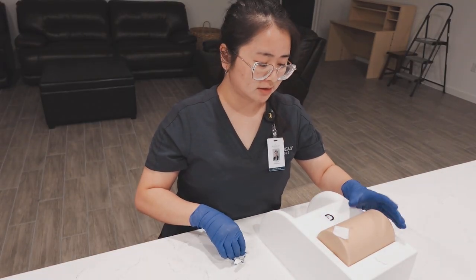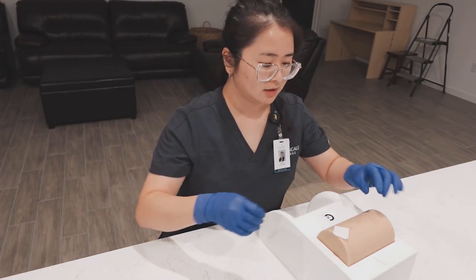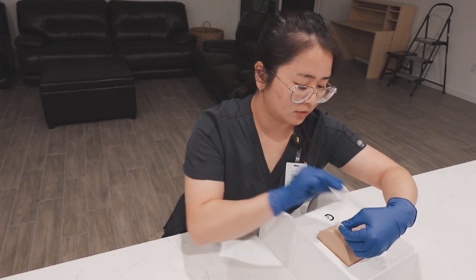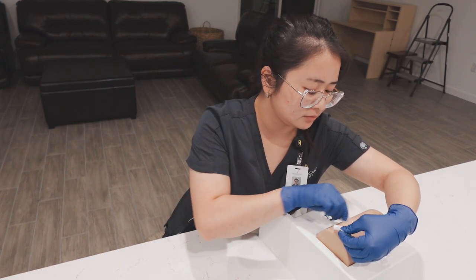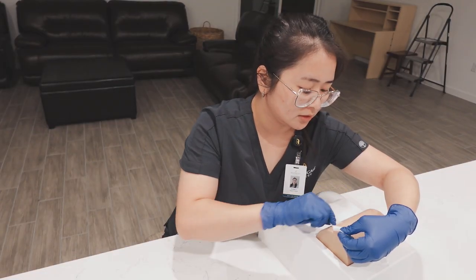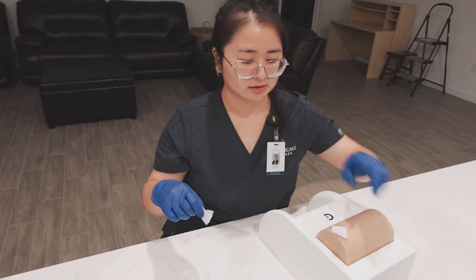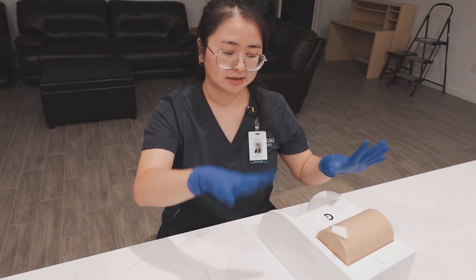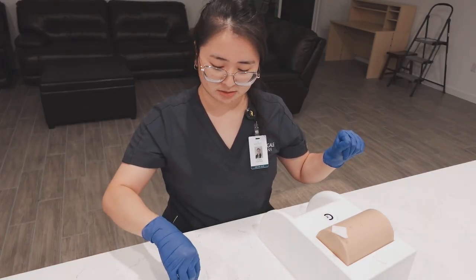Now I'm going to use this alcohol pad, dispose of that in the trash, and I am going to wipe in the middle, outwards, 2 inches.